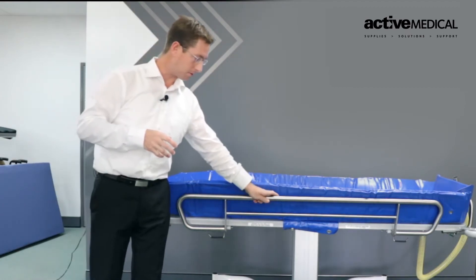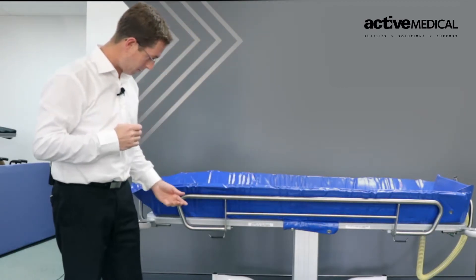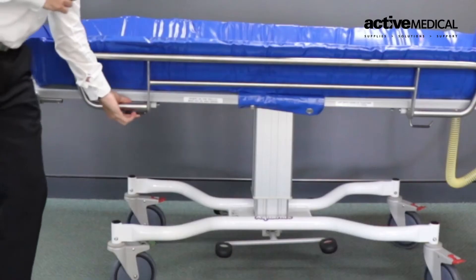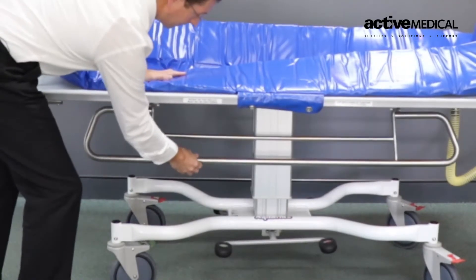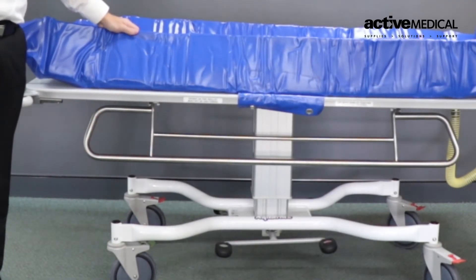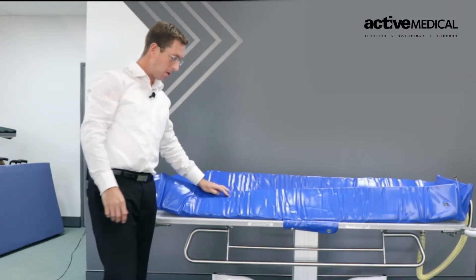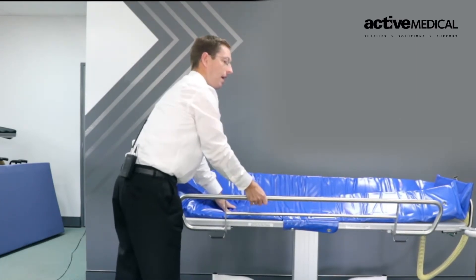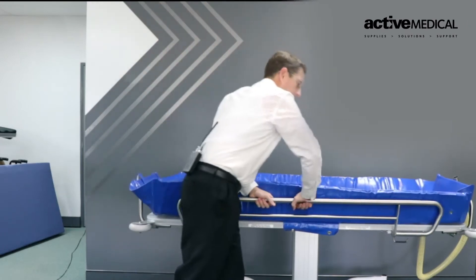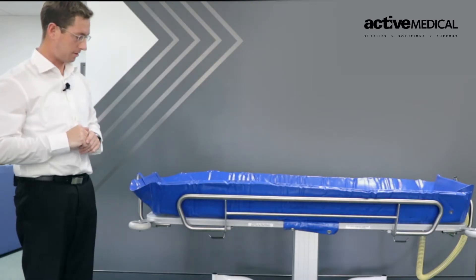We have our side rails — currently they are up. To do a transfer in or out via a Pat Slide, we need to lower them. There is a handle at either end with which I can lower the rail and it will clip underneath, allowing us to get as close as possible to the bed for a safe Pat Slide transfer. To bring it back into position, I simply raise it up and it clicks into place. Ensure it is fully locked before leaving that side of the patient.